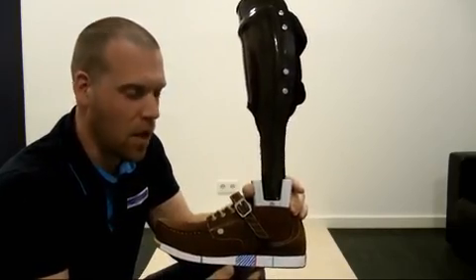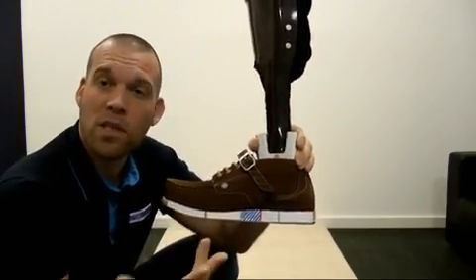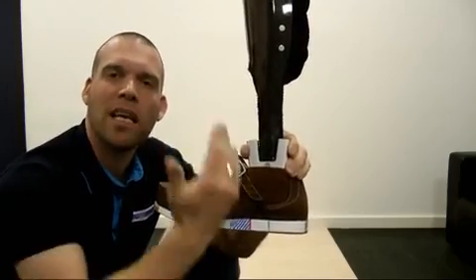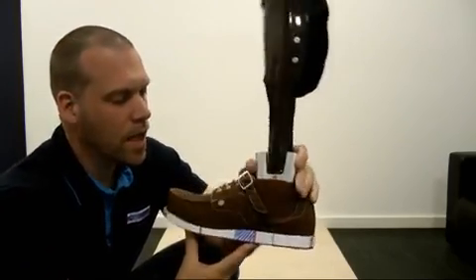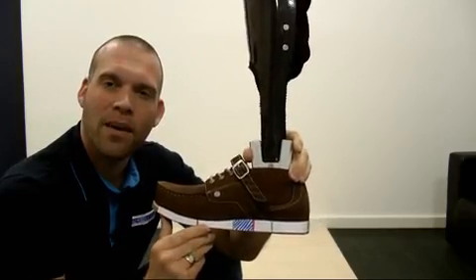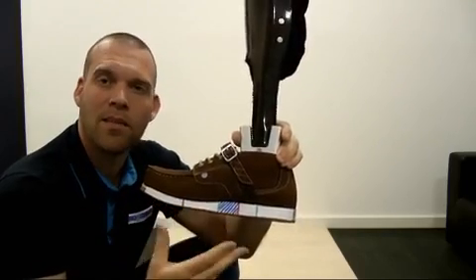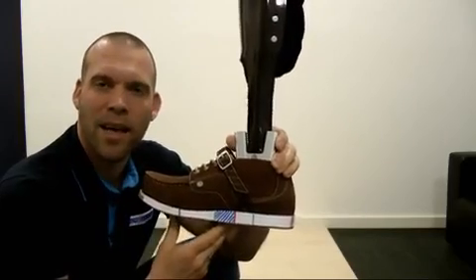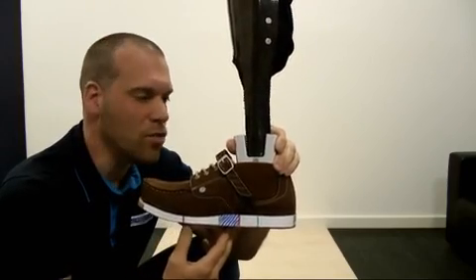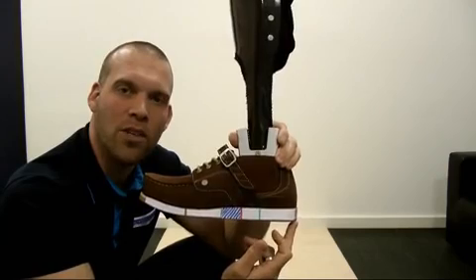The supportive area in this case is actually the foot. The foot significantly increases the supporting area for us bipeds and thus enables us to stand on two legs. But for our patients, who are usually not able to move their toes, this is a very special situation, and thus we have to explain which supportive area is available for the patients a little bit more precisely than in the physiological sense for bipeds. Because in this case, the support surface does not include the entire length of the foot, but it is limited to the distance from the heel edge to the highest point of the roll-off area.